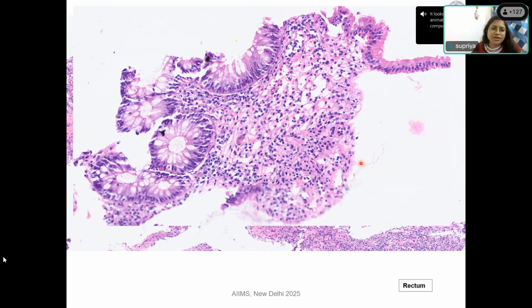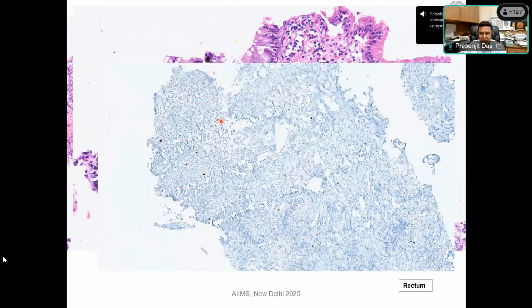So cytomegalovirus infection. Exactly. This is a case where we have done IHC and we are identifying many CMV positive inclusions. So it is a CMV colitis, again to show you and reinforce that patchy chronic active disease is not only because of IBD. If there is no clue, we'll say we cannot tell, you investigate further.